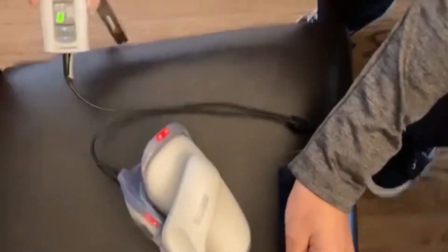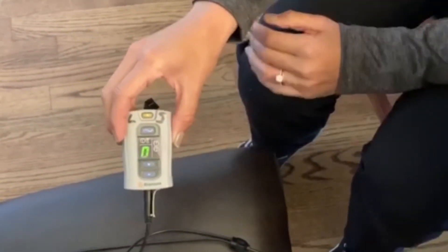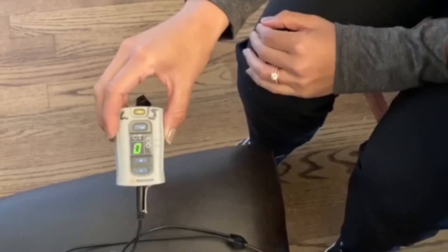For the control unit, the indicator is right here letting you know that it's being charged. When there is a green dash, the control unit is fully charged.